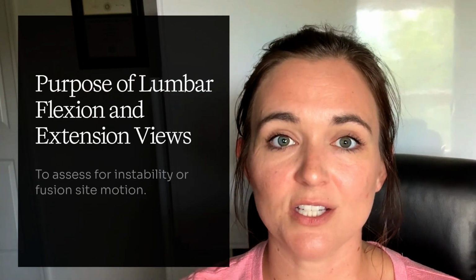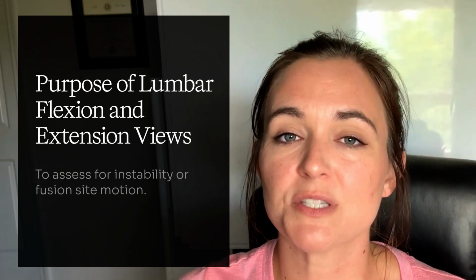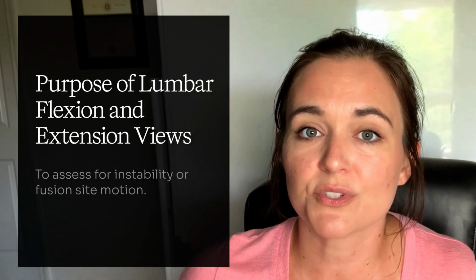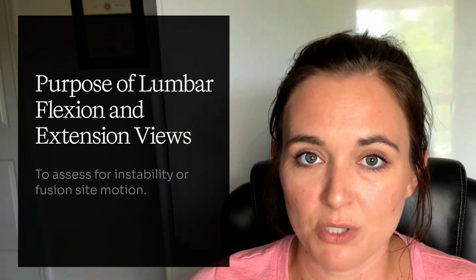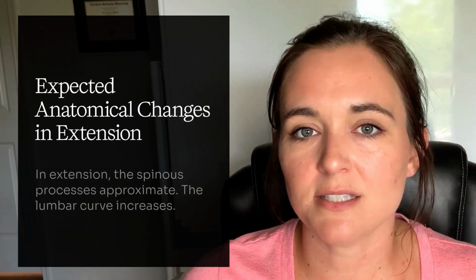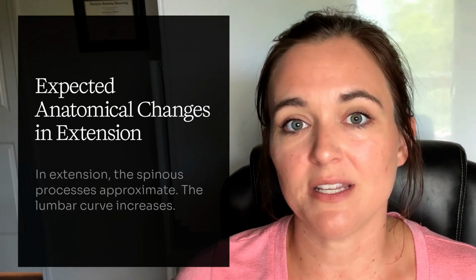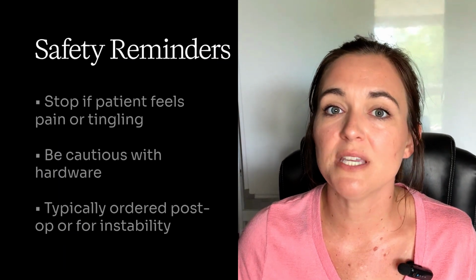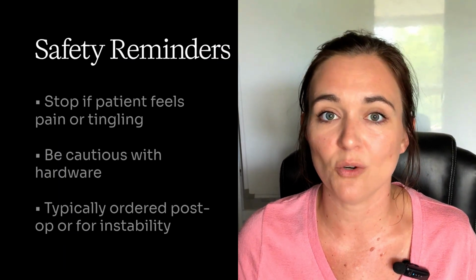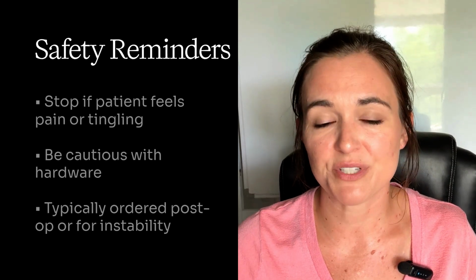Here's an ARRT clue. They might ask something like, what's the purpose of lumbar spine flexion and extension views? The answer is to assess for instability or fusion site motion. Or what anatomical change is expected in extension? The answer is the spinous processes approximate and the lumbar curve increases. Here's some safety reminders. If the patient says they feel pain, tingling, or instability during movement, stop immediately. Don't push through resistance.